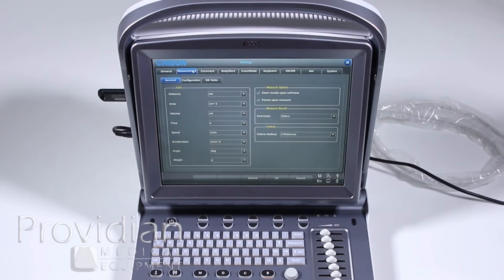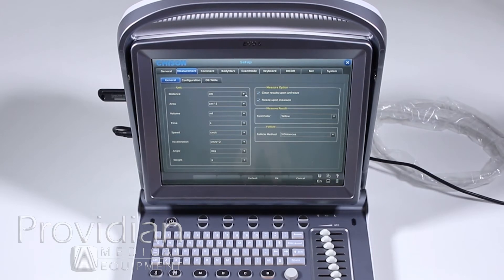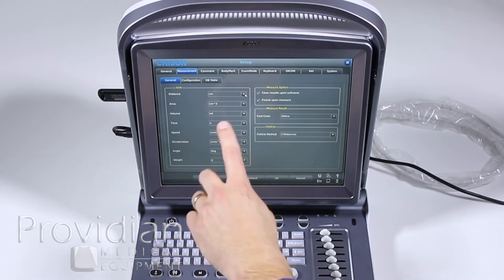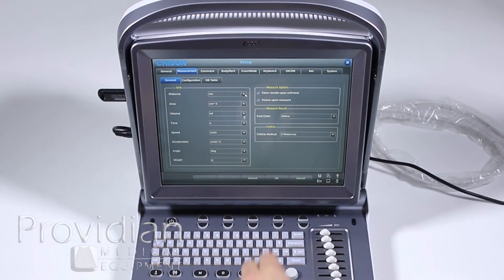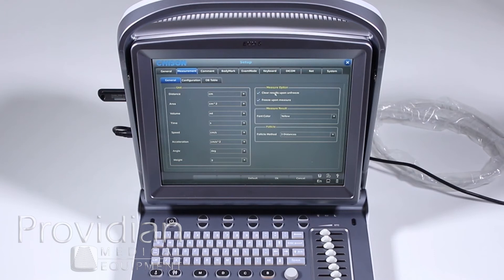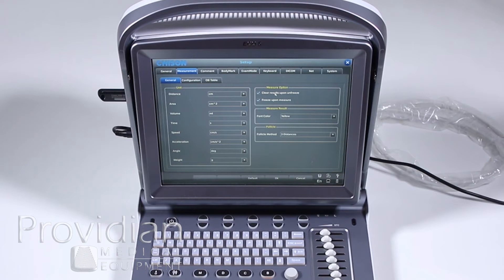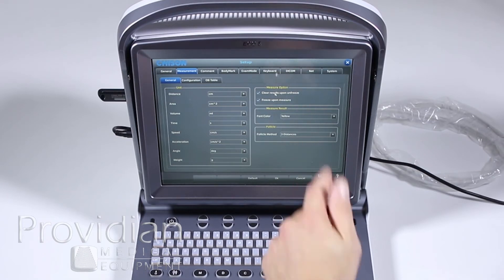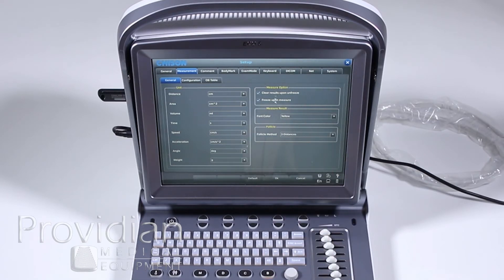Measurements. This gets into how you want the measurements to display and distances, millimeters, centimeters and different units like that. Clear results upon unfreeze. Each time I unfreeze the image, if there are results on screen, it would clear that. If I want those results to stay on screen, I would uncheck this box and then freeze upon measure.